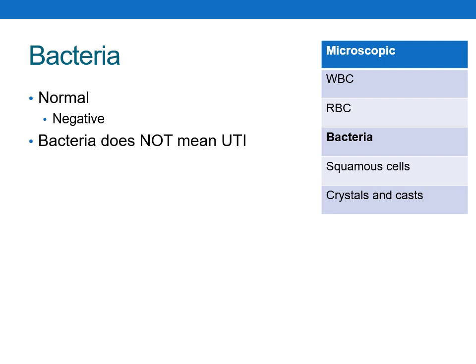To put this in a little bit of perspective from the HPF fields that we talked about earlier, about 5 bacteria in one of those visual fields would represent about 100,000 colony-forming units, which is the classical amount of bacteria present that you need to diagnose an asymptomatic bacteriuria.